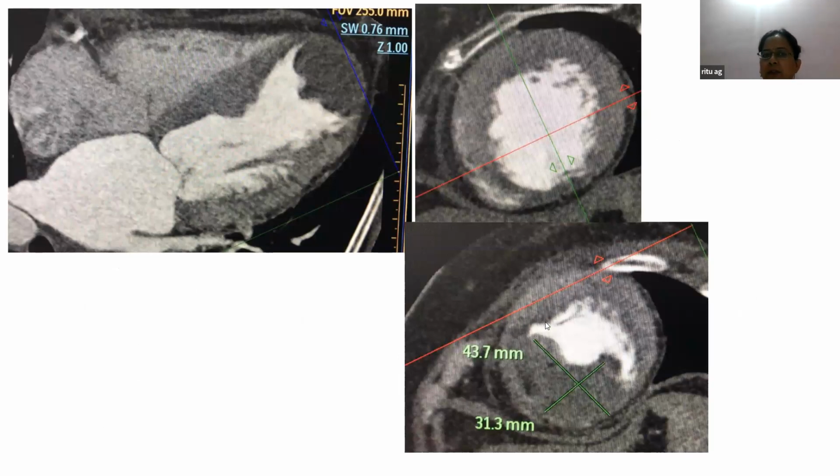So this was one of our patients. For some weird reason, this thrombus was not seen on echo. It was something to do with the echogenicity of this thrombus. We did a CT before the TAVR, found this thrombus, and then the cardiologist successfully implanted a TAVR valve using bilateral carotid filters to prevent any microemboli to the brain. So this is how TAVR imaging, these images of the heart that we get, not only gives us information for sizing of the valve, but allows us to give a lot of other additional information.